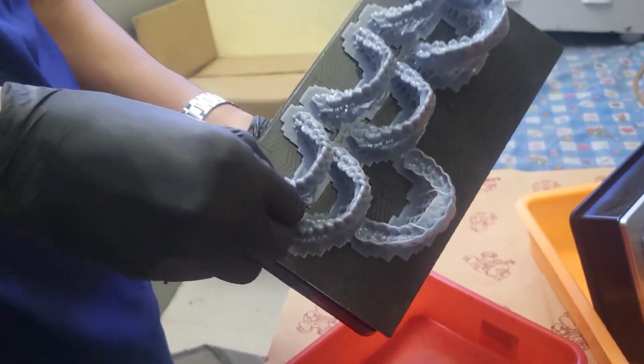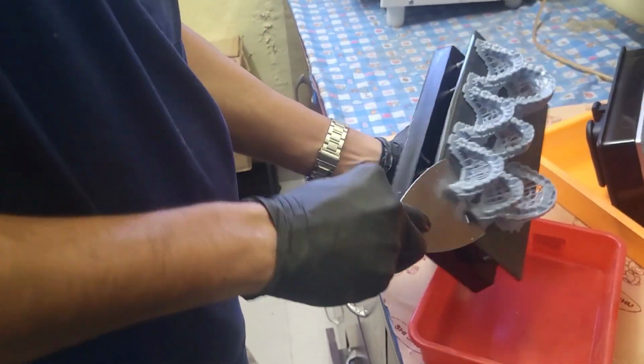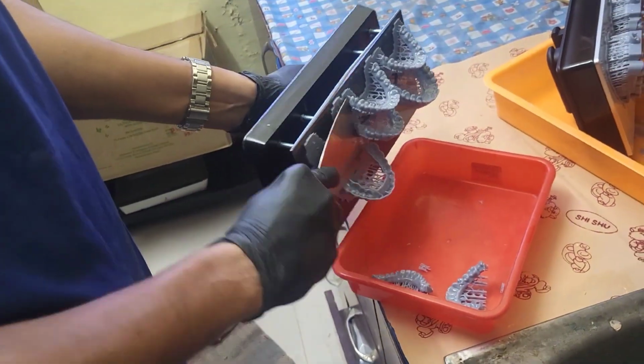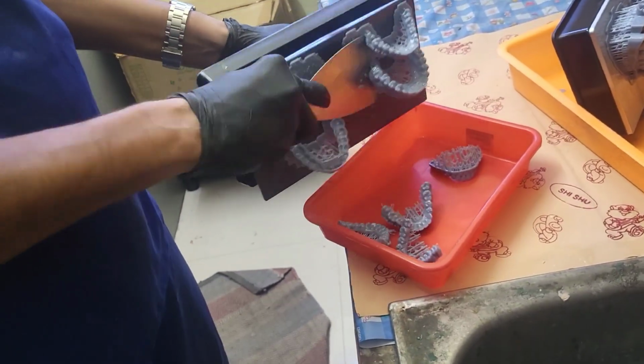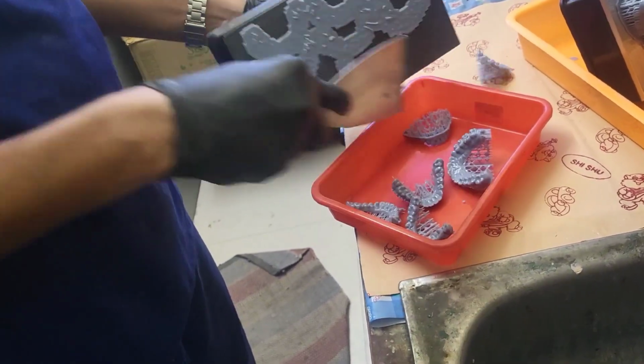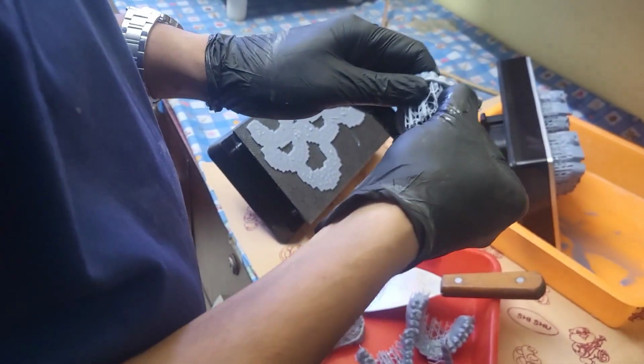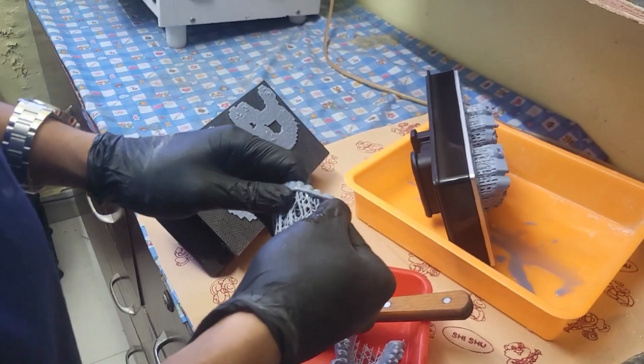Supports: except the tooth bearing portion and the tissue surface, we have to remove all the material from the model.